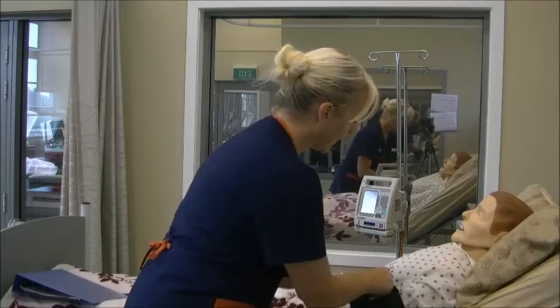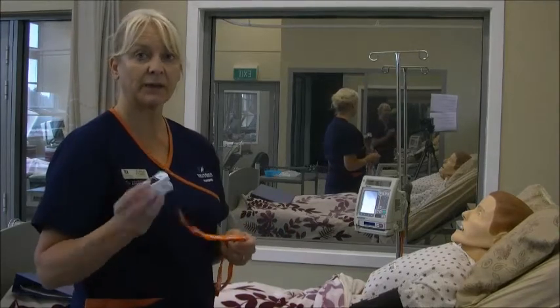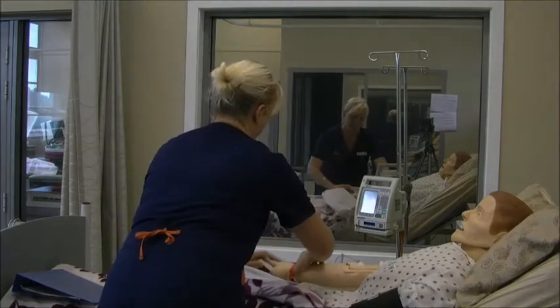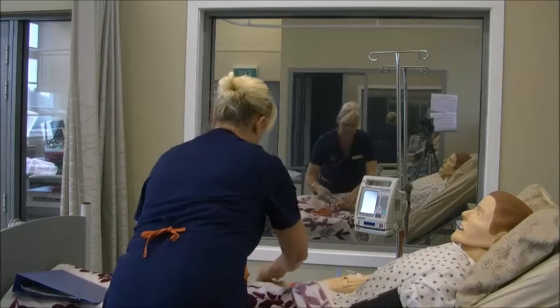So while I put that cuff on, even though I'm not concerned about his respiratory system, it's an assessment that I can make with the O2 SATS monitor. I can put that on at the same time. I'll just pop your arm up there and pop the O2 SATS monitor on.